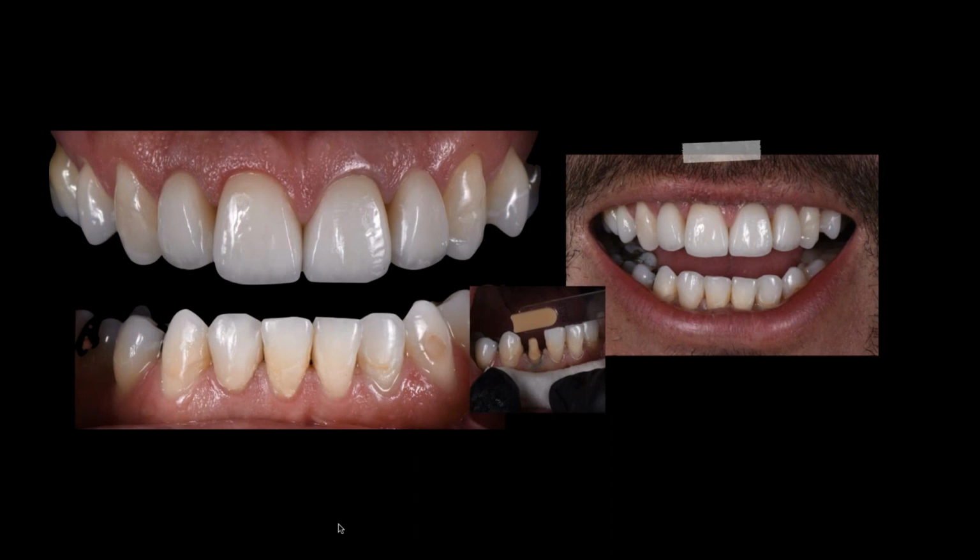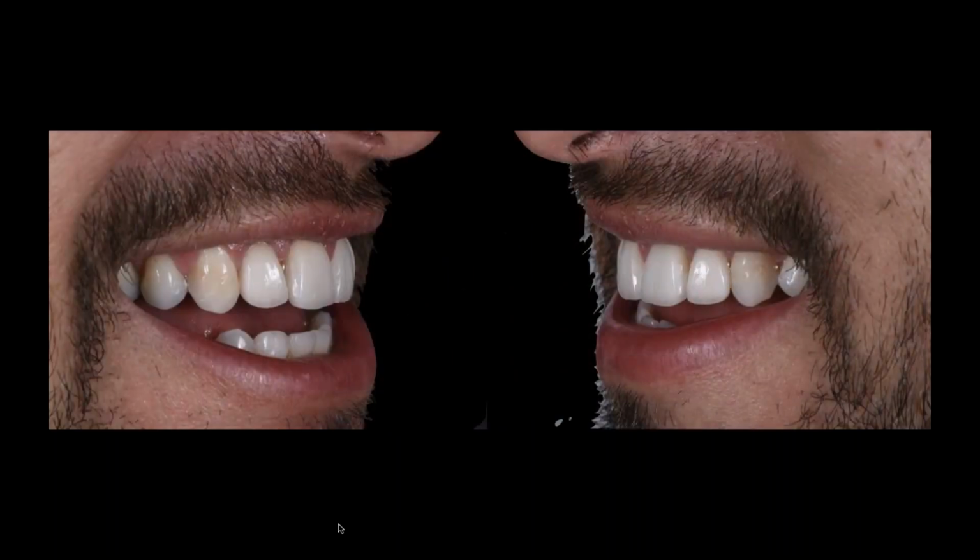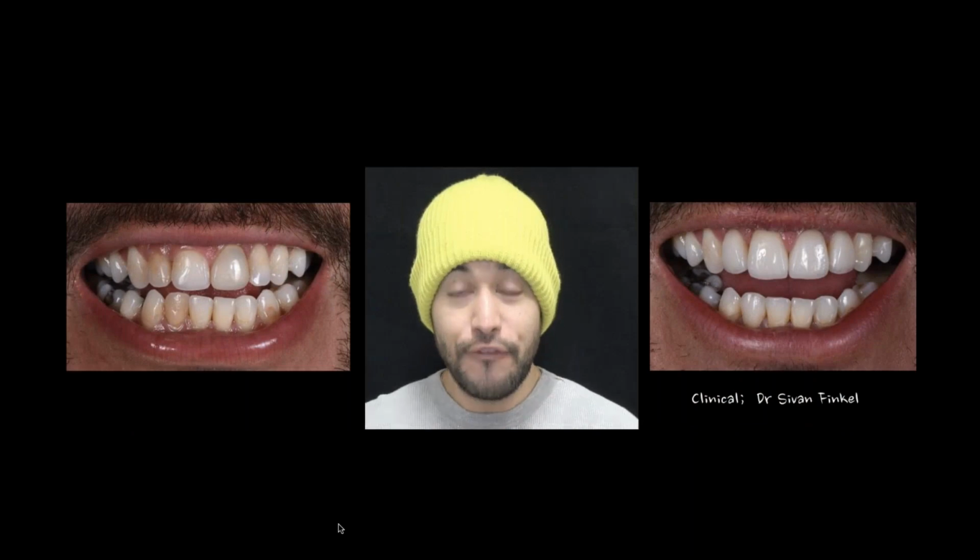And I think it's kind of ironic that as we develop new materials, we're always developing in the more translucent world. Nothing wrong with that. We need that, especially for monolithics. But also, again, our job is to know when we need opacity. And in this case, I needed the opacity, not the translucency. So you can see this case is a lot more challenging for that, because I had to mask a certain amount of dark prep. I had to work in very small areas, and yet I had to make them all work together. Again, opacity was the key.